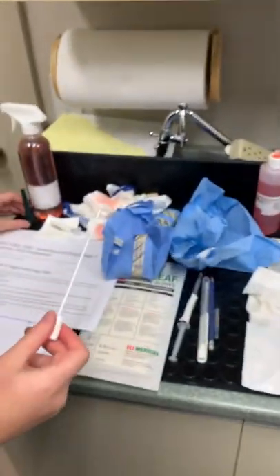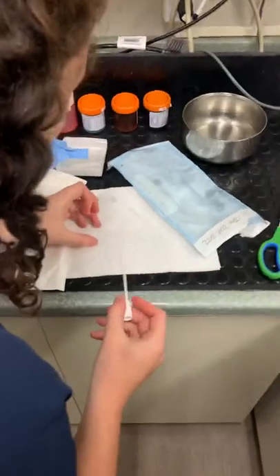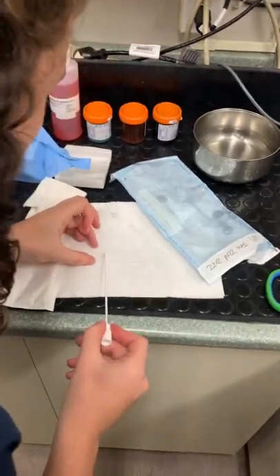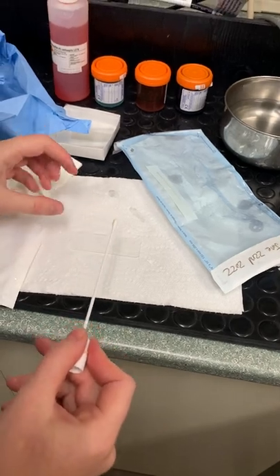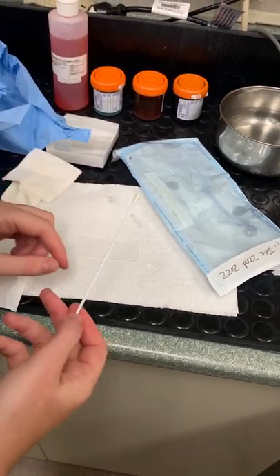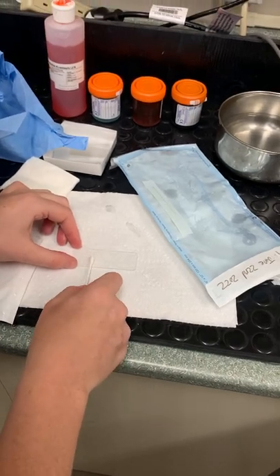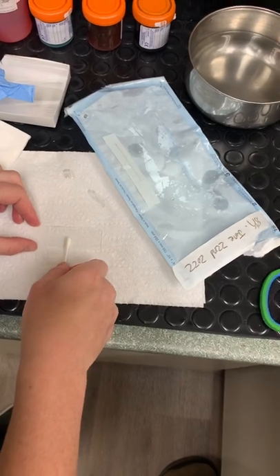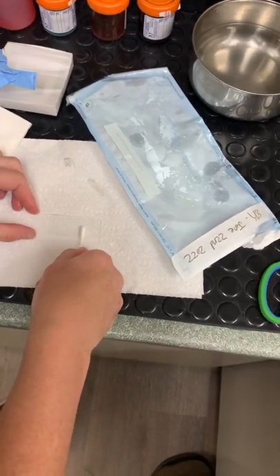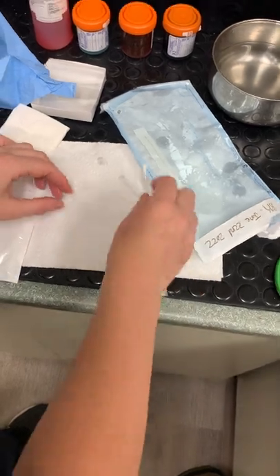I'm going to roll it on our slide here. Hold it closer to the actual swab — take your fingers in your right hand and hold it closer to the swab. Put a little bit of pressure on that, right? Just bend the swab gently as you gently roll it. That's it. Okay, good. And stop the video for a minute.